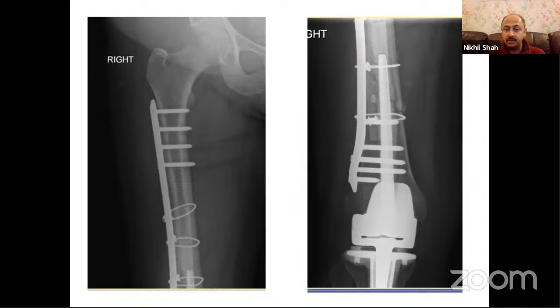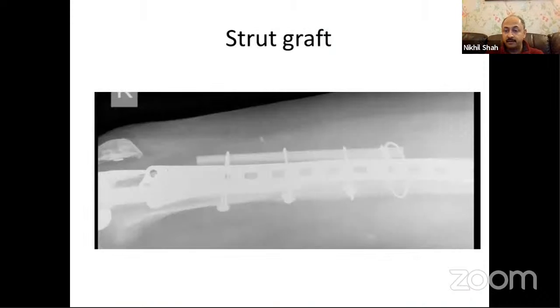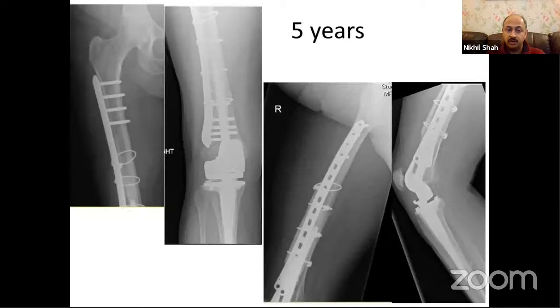So this was the fixation that was achieved. And what I like to do anteriorly is to put a strut graft. I'm not a big fan of the second plate because I've seen a lot of problems with the second plate. It often devascularizes the fracture and it causes a lot of stress shielding in the zone of the fracture. So I prefer to use strut grafts, and I've used about 22, 23 of these with a good long-term follow-up, and we are hoping to get it published soon. So this is what I tend to do, use a strut graft. We have it on the shelf, and there is a particular method by which I prepare the strut graft. And you can see at 5 years, the fracture has healed, the strut graft has healed, the prosthesis hasn't loosened, and she has excellent function.